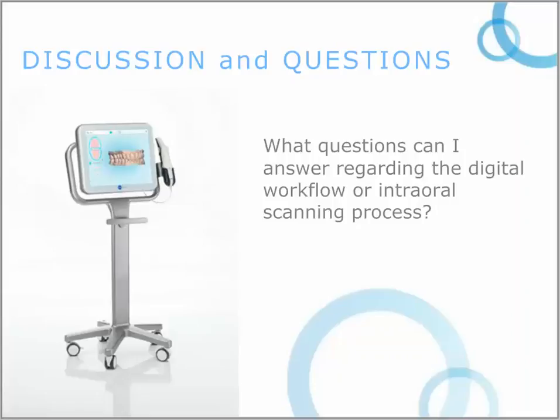We stopped using conventional impression material, I don't know, certainly 3, 4, 5 years ago. The rules apply the same. You have to have a direct line of sight. So that means an electrosurge, a laser, to be able to get any tissue that's in the way so that you have a direct line of sight.